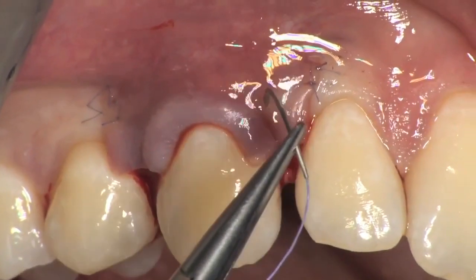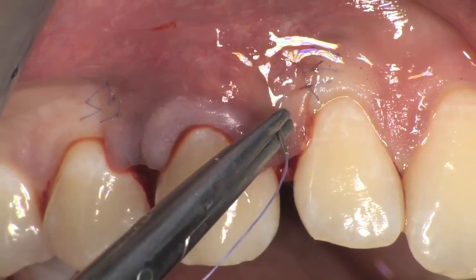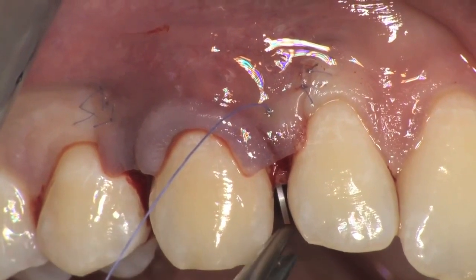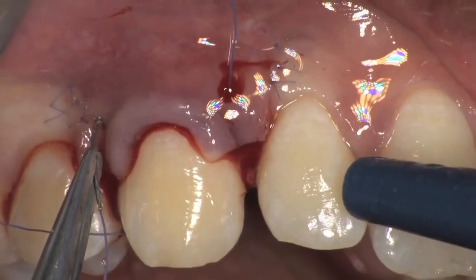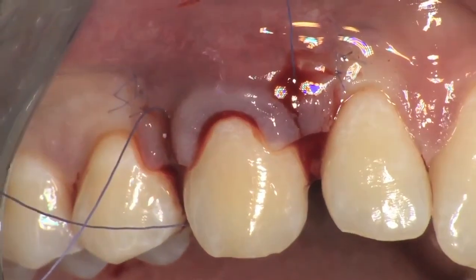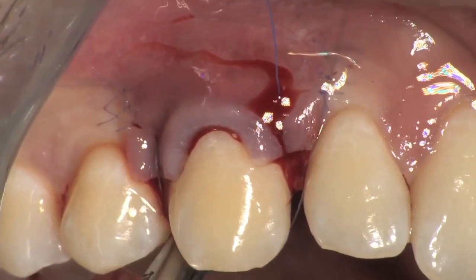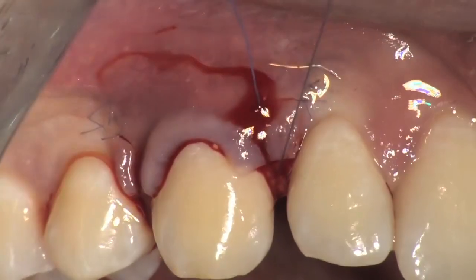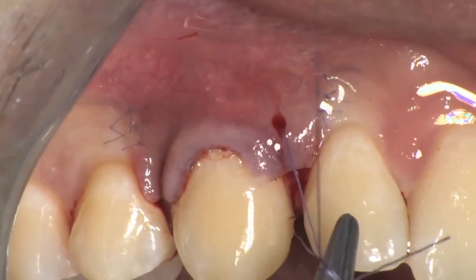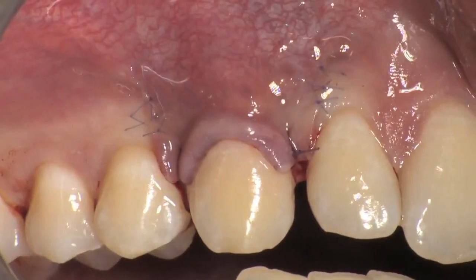After the vertical releasing incisions have been sutured, sling sutures are made to suture the surgical papillae in place, which is done by perforating the surgical, anatomical, and palatal aspects. The suture is turned around the palatal cingulum of the tooth and then brought back buccally below the contact point, where the perforation through the surgical, anatomical, and palatal aspects is repeated. The suture is then brought back to the starting point where the knot of the sling suture is closed. This suturing technique helps to achieve a double compression of the surgical papillae above the anatomic papillae and a perfect adaptation of the keratinized tissue above the convexity of the clinical crown.